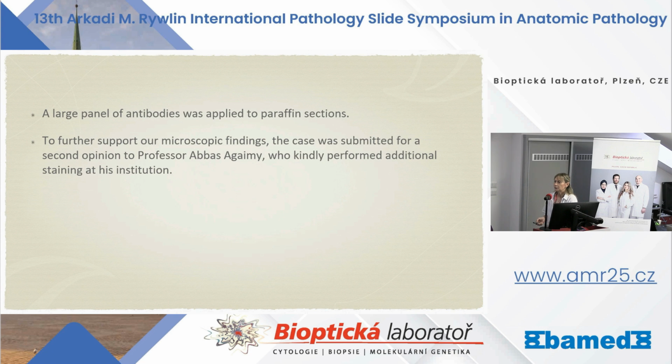We performed a large panel of antibodies to further support our microscopic findings, because we had an idea, but as always, the immunohistochemistry is needed.